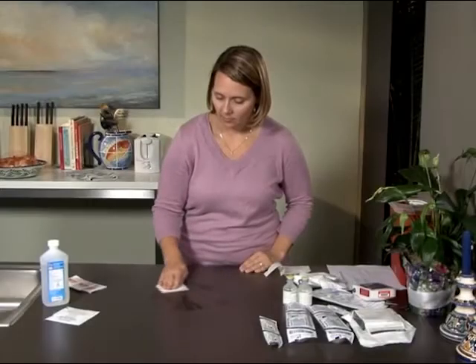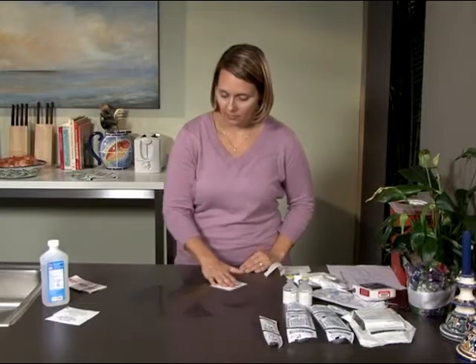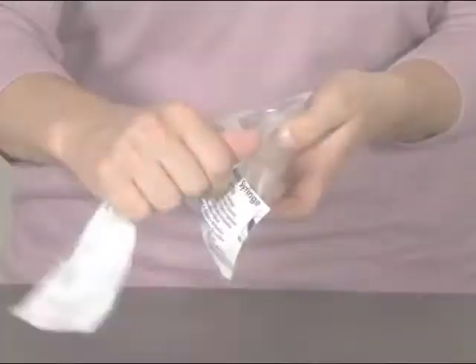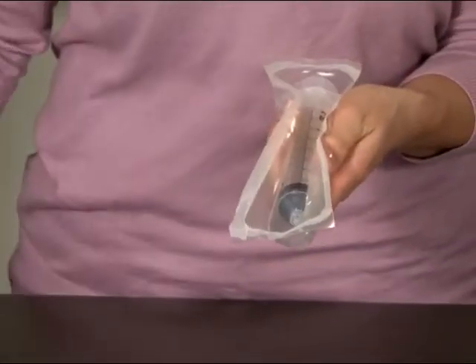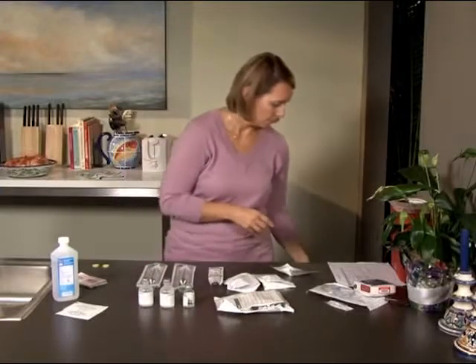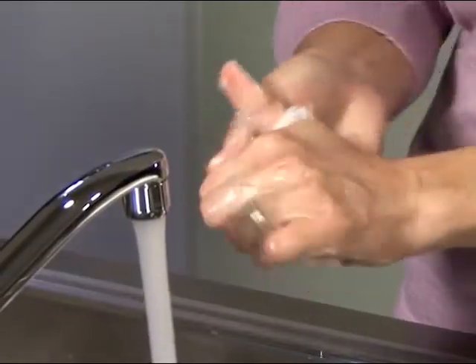Once you have all your supplies, clean your work area thoroughly using isopropyl alcohol and a swab. Open the supplies and place them on the work surface you just cleaned. Discard all packaging, and thoroughly wash your hands again.